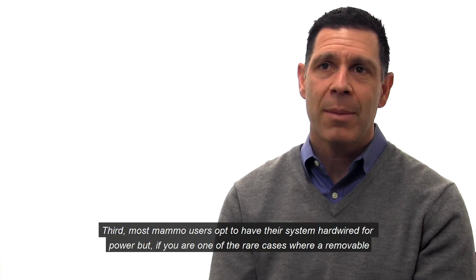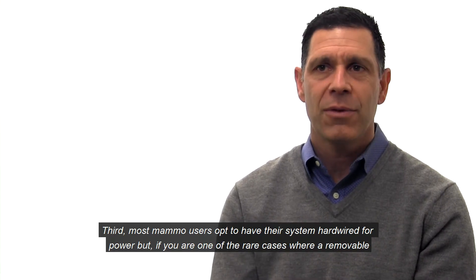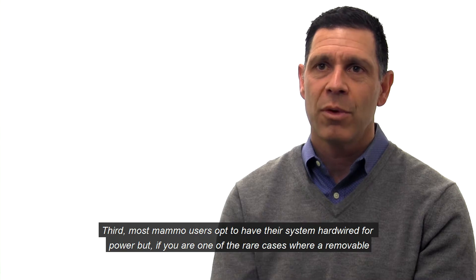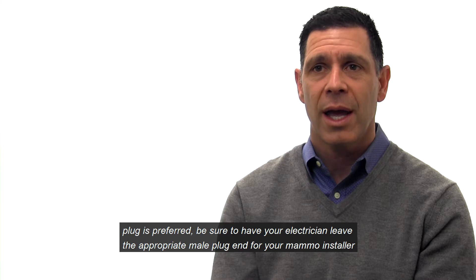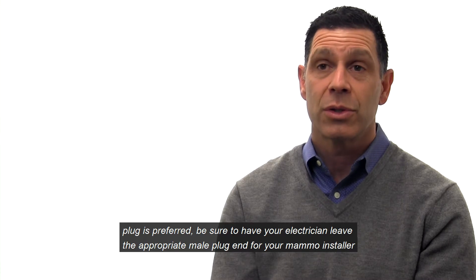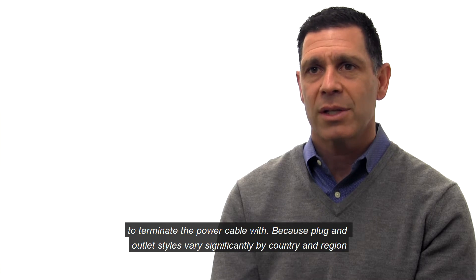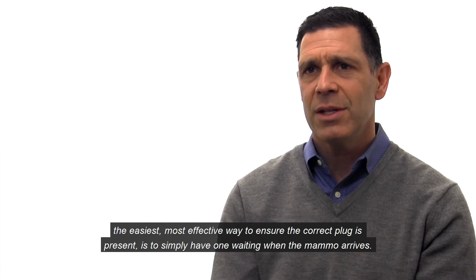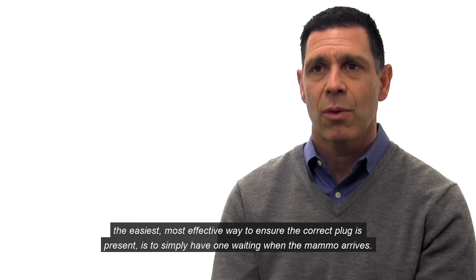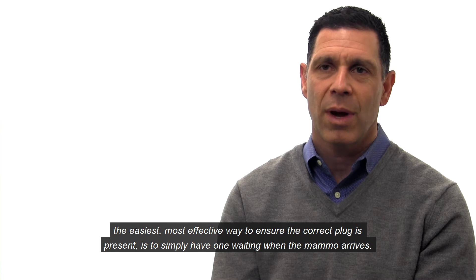Third, most MAMO users opt to have their system hardwired for power. But if you are one of those rare cases where a removable plug is preferred, be sure to have your electrician leave the appropriate male plug end for your MAMO installer to terminate the power cable with. Because plug and outlet styles vary significantly by country and region, the easiest, most effective way to ensure the correct plug is present is to simply have one waiting when the MAMO arrives.